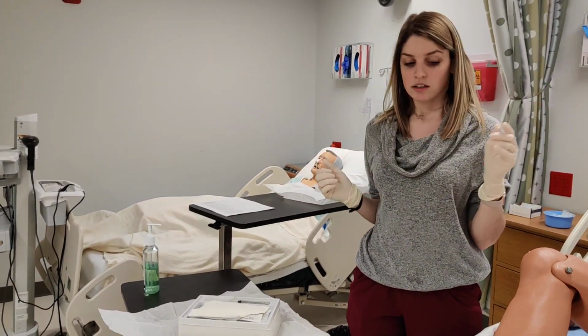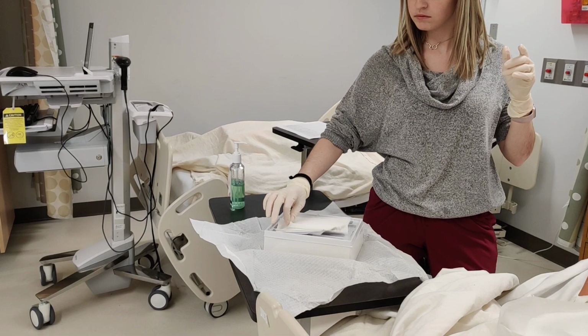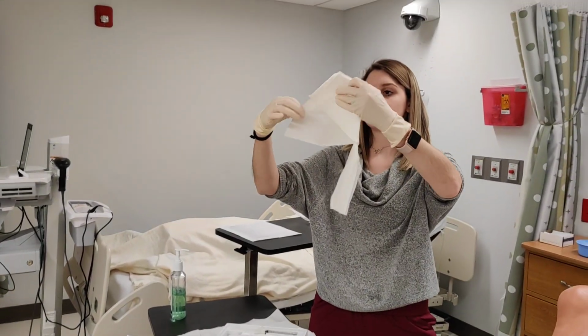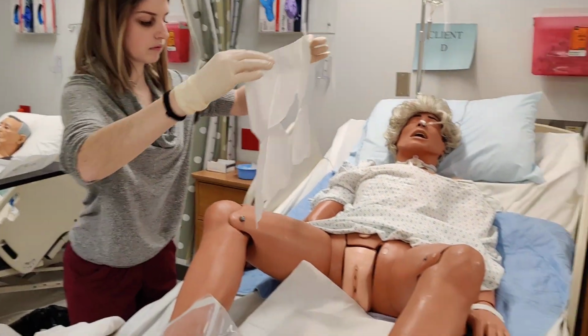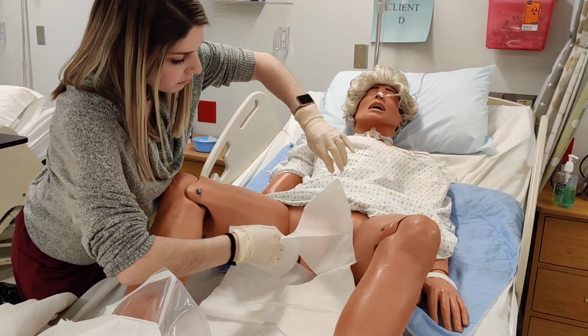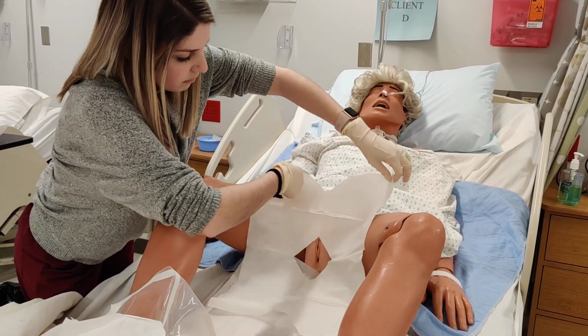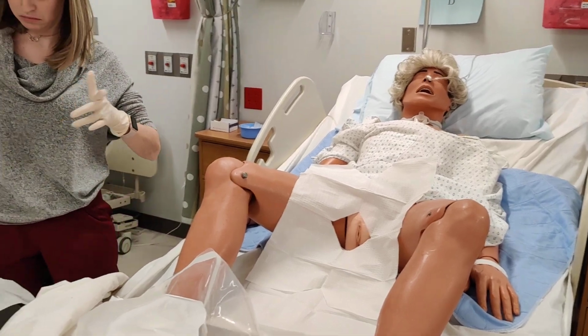All right, so once she has those on, she has another drape. That's a fenestrated drape, a drape that has an opening in the center. She's going to drape that over the patient. And that way only the working area is exposed.